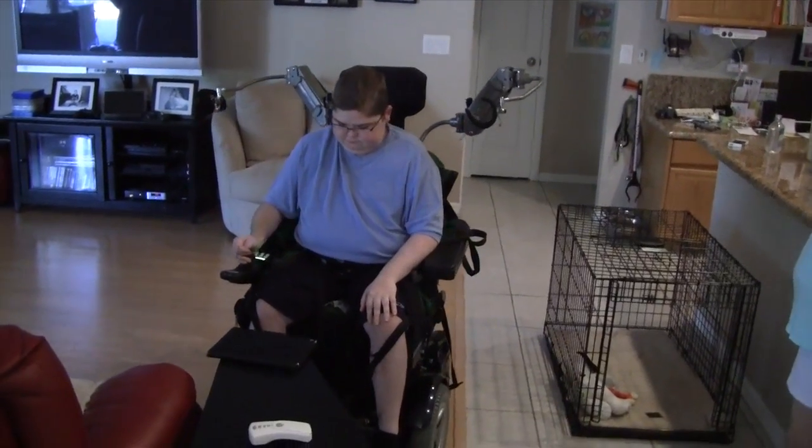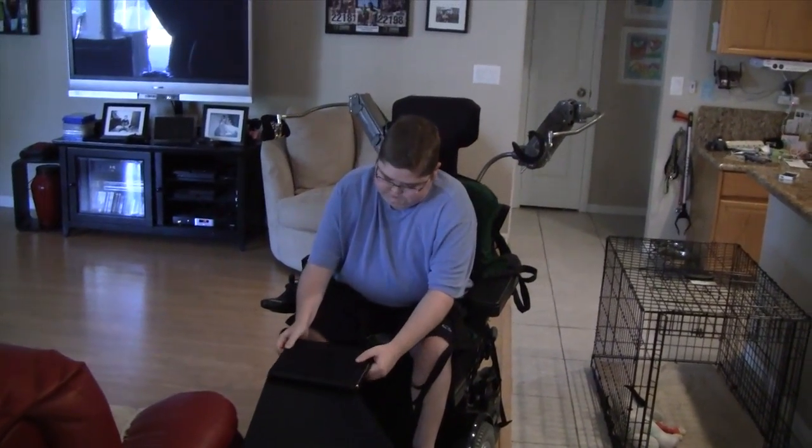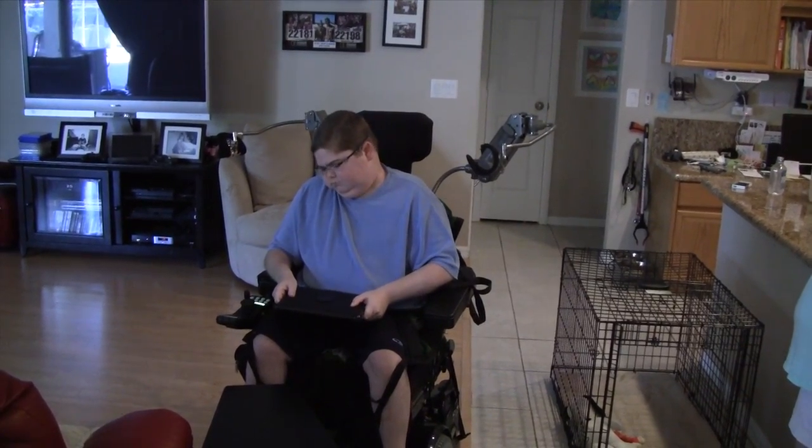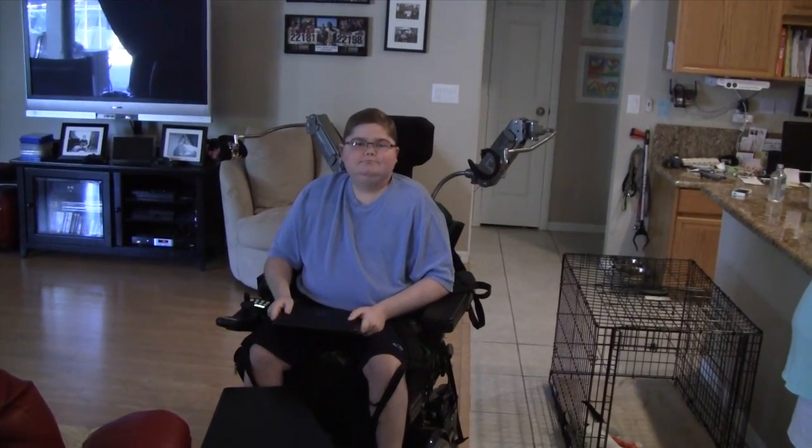Okay, without the AR arms. Now we can get it over to the lap — pick it up a little higher. That's it.